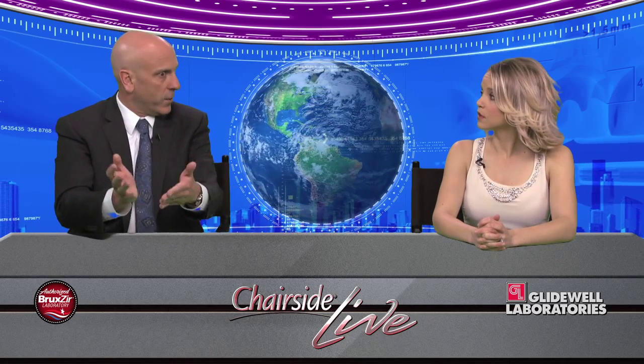And about 2 weeks ago, Rella Christensen, the wife of Gordon, who we had obviously on here and interviewed her, and we should have interviewed Rella. Note to self, next time Rella's in the building, interview her. She was talking, in fact, she was down here because she wants us as a laboratory to create buccal veneers. And so they're going to look like, kind of like porcelain veneers that you put on front teeth, except they're going to go on the first and second molars of children, when they get their first molar, and then their 12-year molar when they get that.